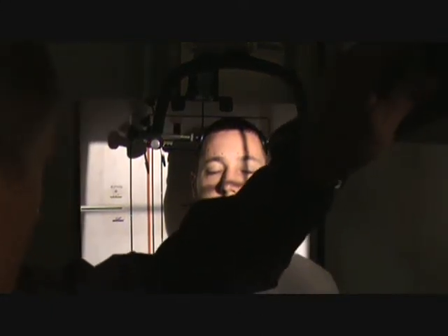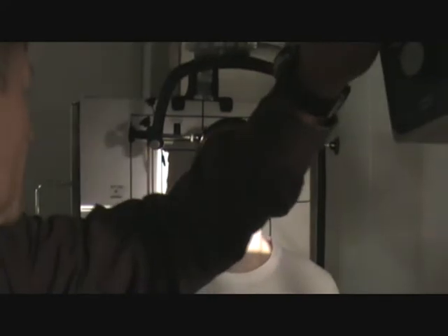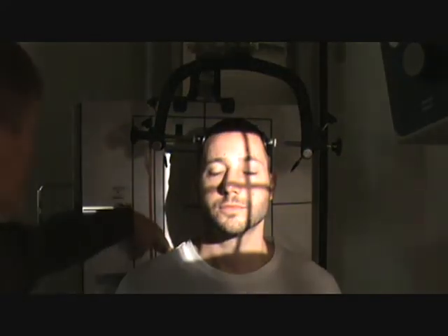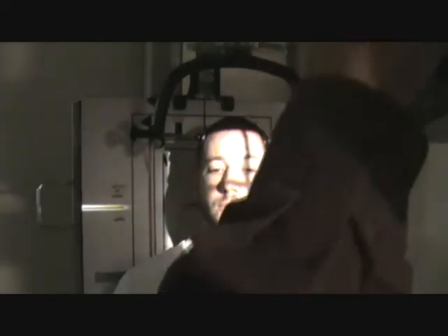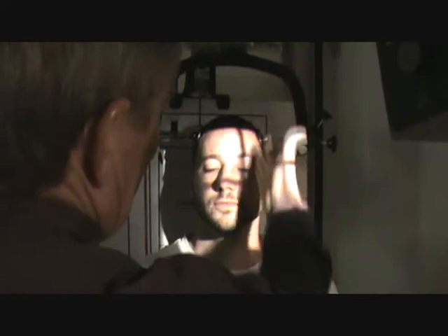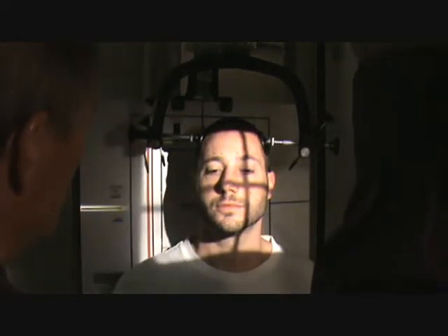We're taking digital film, so we're using a 10x12 cassette. We'll collimate in a half inch on the top of that 10x12 and bring it in to the R marker. Now, we said we wanted to take this one as a stereo. Once the patient is all lined up, if we were to shift the tube, we would cut off a side of the head with the collimation, so we don't want the collimation all closed down at this point.